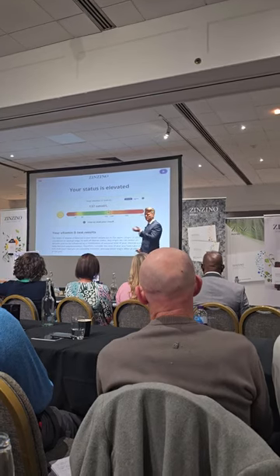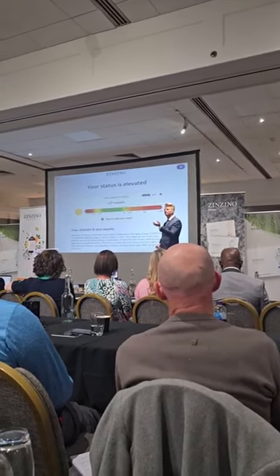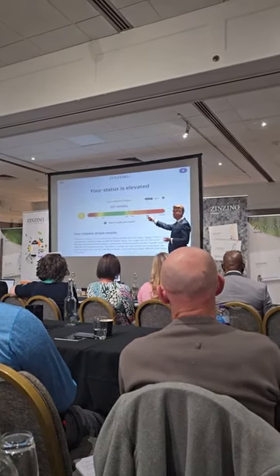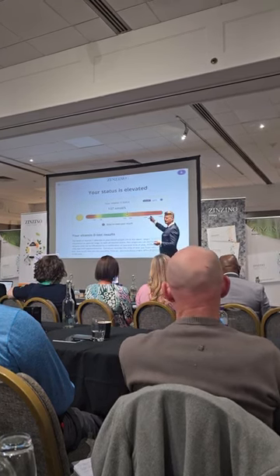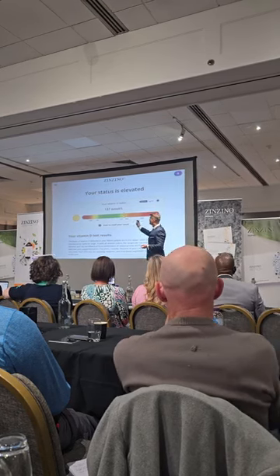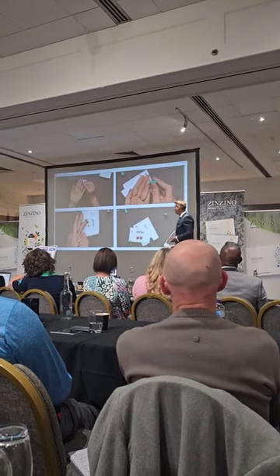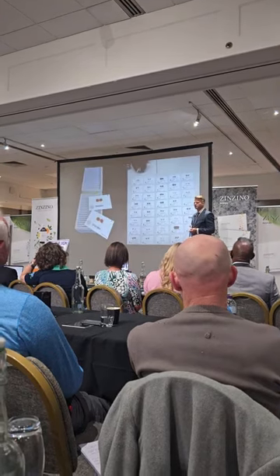What is not the purpose of the test is to establish if your concentration is 55.5 or 55.8, right? Because it doesn't really matter. Or if you're 20 or 21, because you're deficient anyway, right? Or if you're 200, 400, 600. So it's less accurate up here and mostly accurate down here. This is the design of the test, right? You understand? Okay.